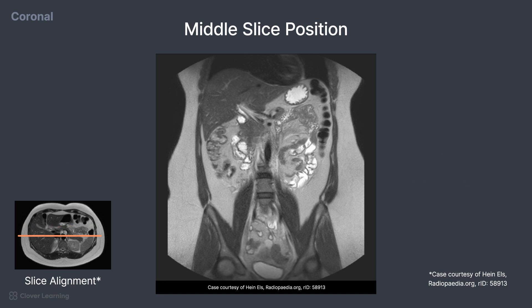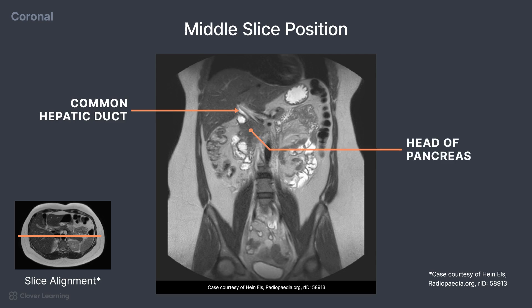While demonstrated better on an MRCP, you can see a small portion of the common hepatic duct emerging from the liver, along with the head of the pancreas.